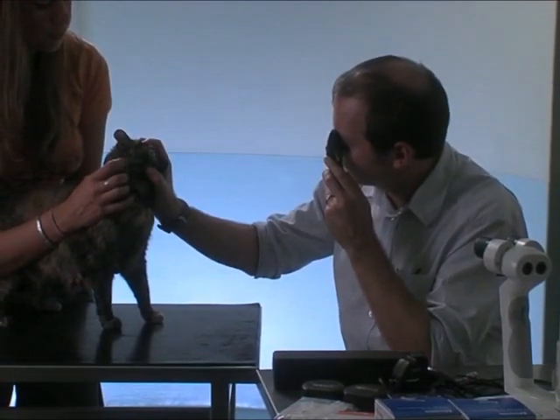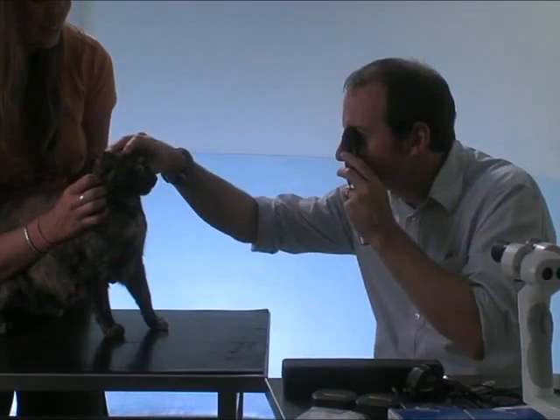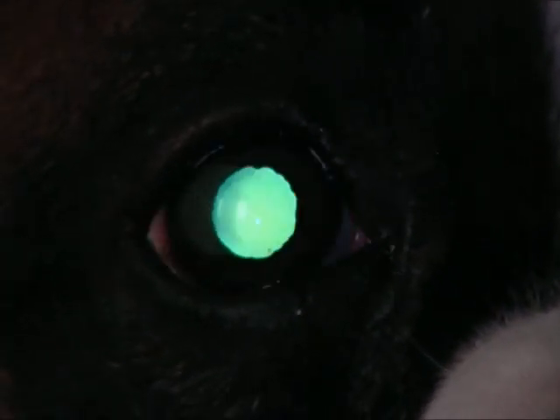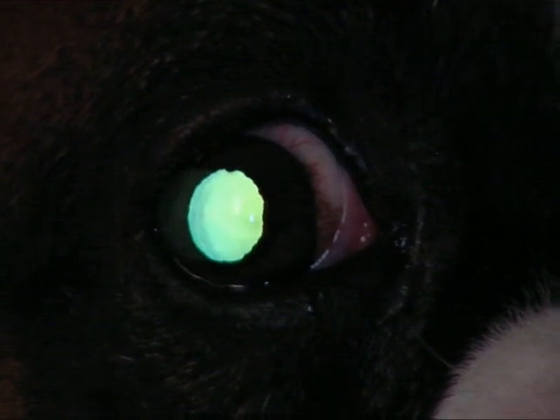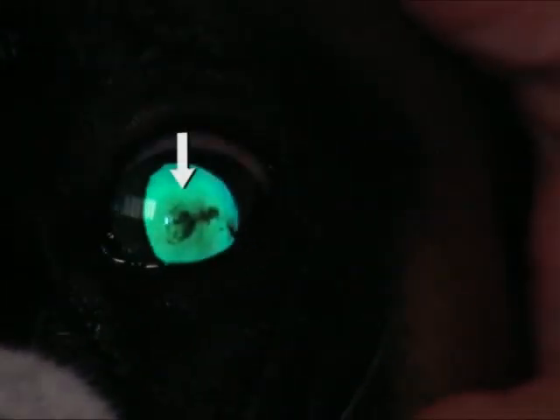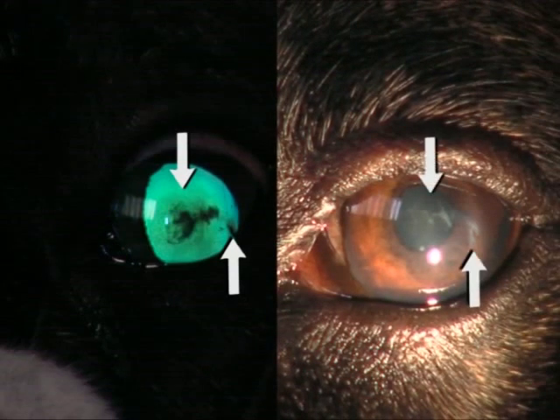The aim is to locate the tapetal reflection, remembering that the tapetum is in the top half of the fundus. In the normal eye, the tapetal reflection is uninterrupted, with light transmitted evenly through the lens. In contrast, a physical opacity such as a cataract will scatter the reflected light, creating areas of darkness. Here there is also a second opacity caused by a corneal scar. This is how these lesions appear under standard illumination.